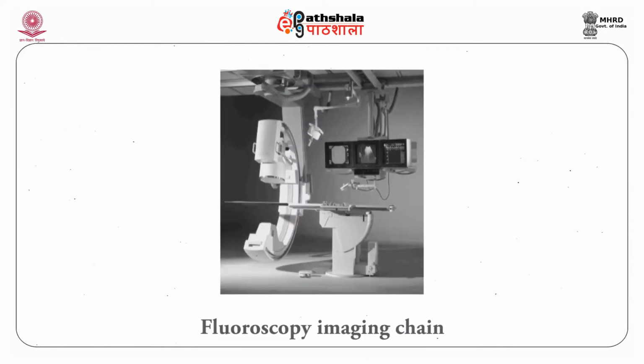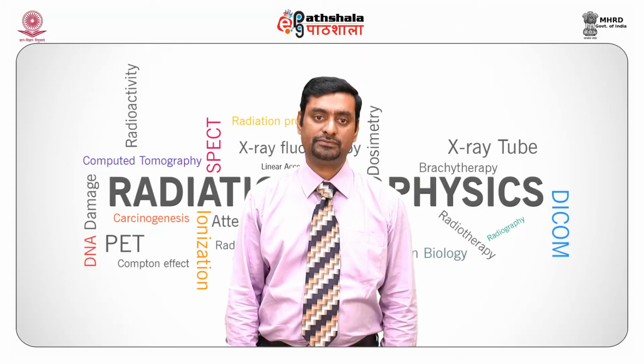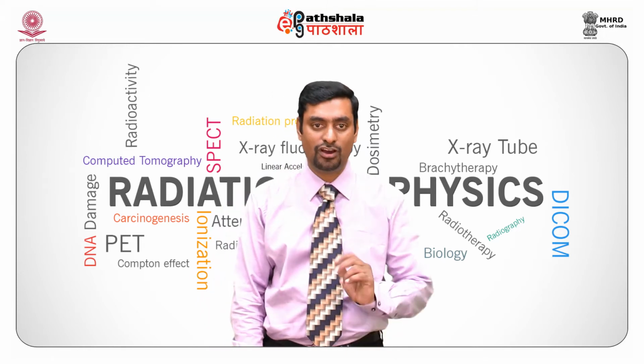In fixed machines, their X-ray tube rating is up to 1100 mA. In mobile machines with a stationary anode X-ray tube, the rating is about 8 to 11 mA, as seen in the image.